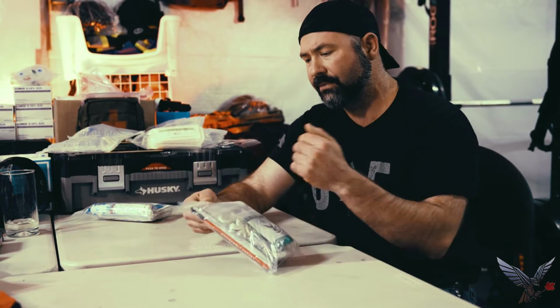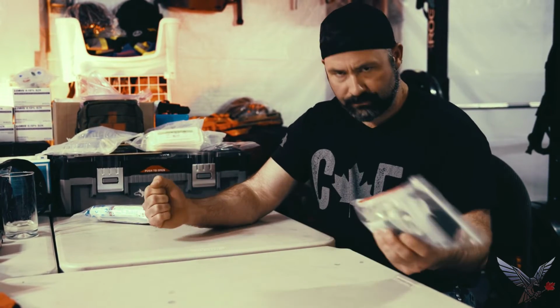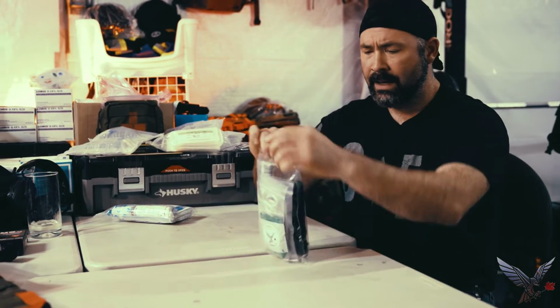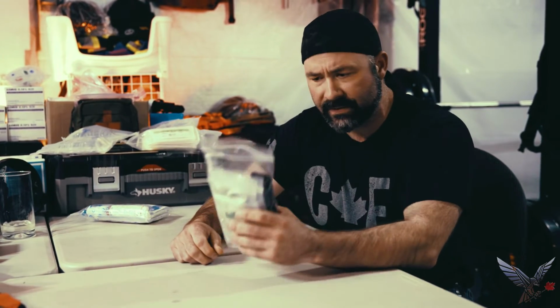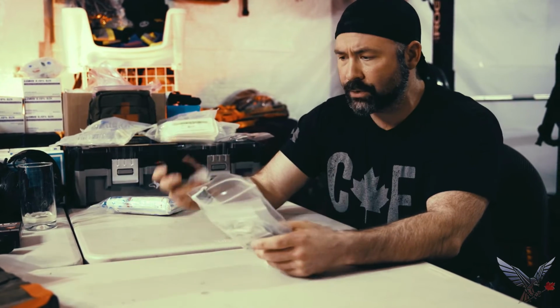So this is the care under fire kit. Now, you've got a tourniquet on you because you are wearing a tourniquet. This one has an extra tourniquet in it because you have two legs. And what I think when I hear care under fire is I've got a casualty and we've got to get them out, and they may need to walk out if possible, even if they've been shot through a leg. So should they be shot through two legs or a leg and an arm?